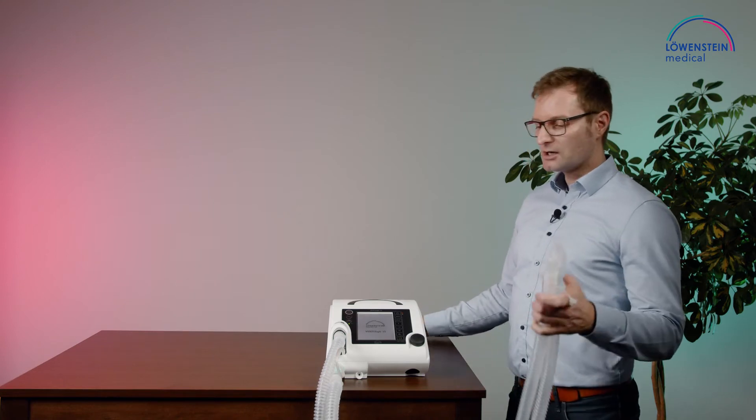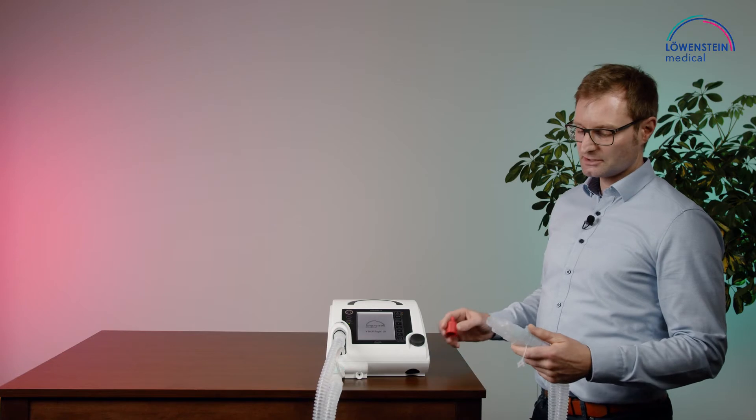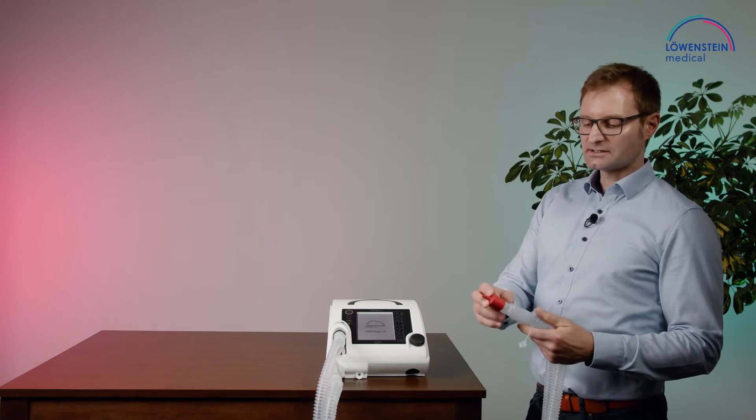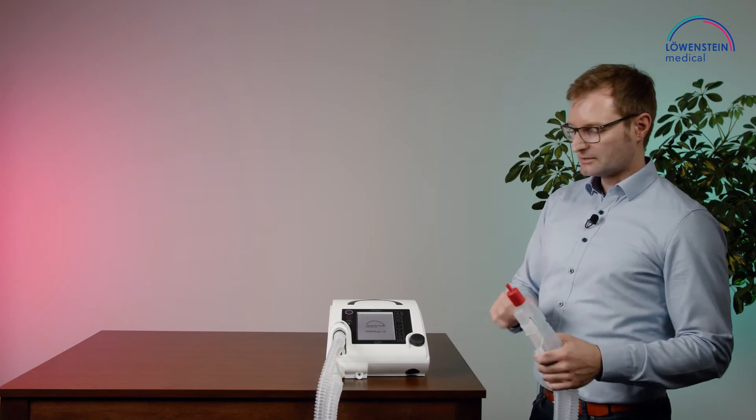For the valve systems, like double circuit or single circuit with the valve, we need this adapter, and this needs to be put directly on the circuit.